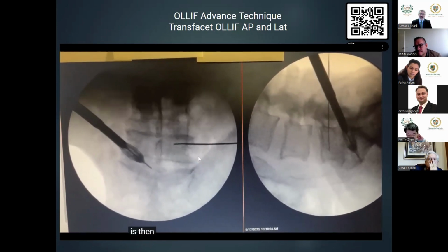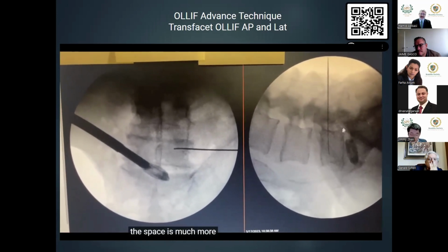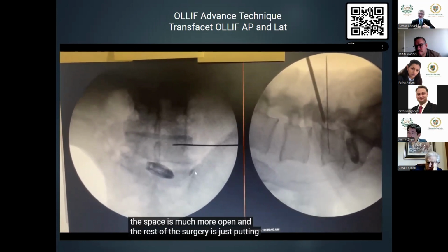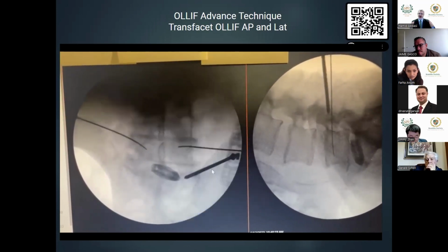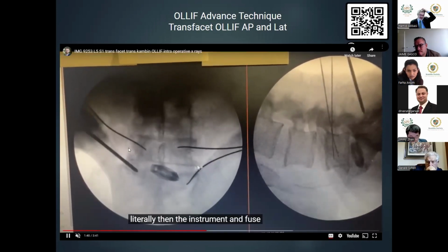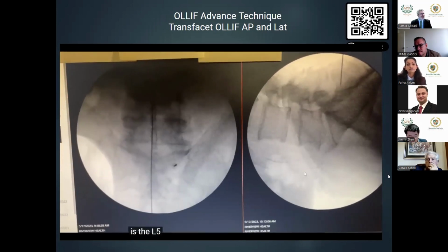The safety profile of it is much better than if you cannot get the right angle and have to push the nerve to the side, because as you see, you're truly in the axilla of the nerve between L5 and S1, and nature, God, evolution gave you really a free pass here. So I will talk in one of our next meetings more extensively only about this, but we have a few other things I want to show you.